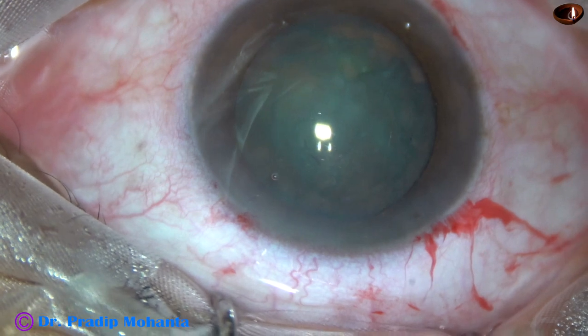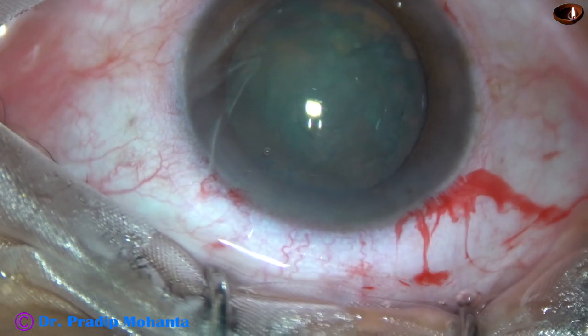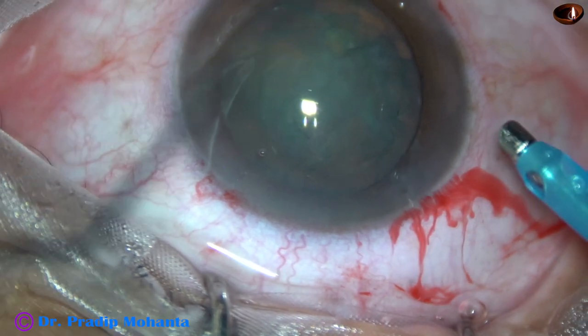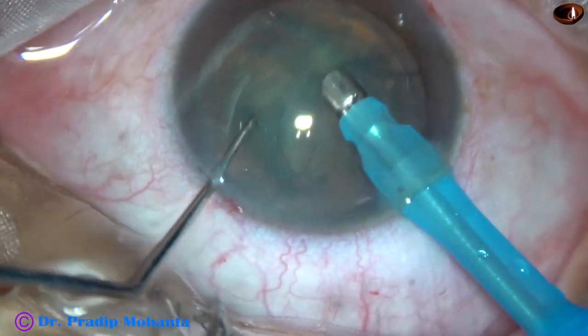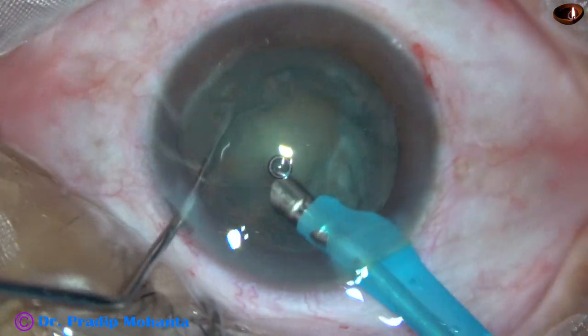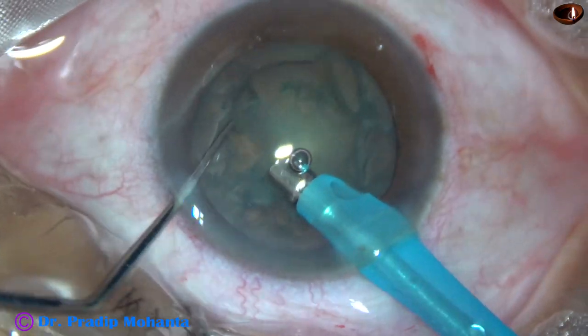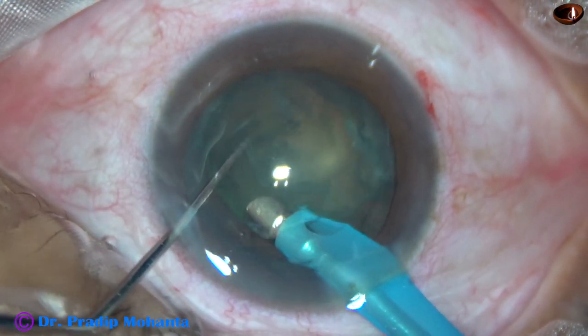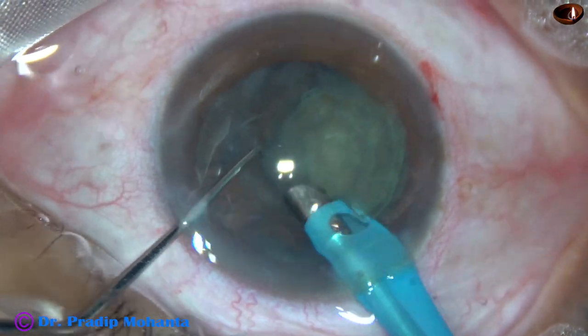And now we can see that the nucleus is very soft. We cannot hold this nucleus with vacuum. So, some superficial cortical lens matter is removed. And then, the tip of the phaco needle is placed at the edge of the nucleus.